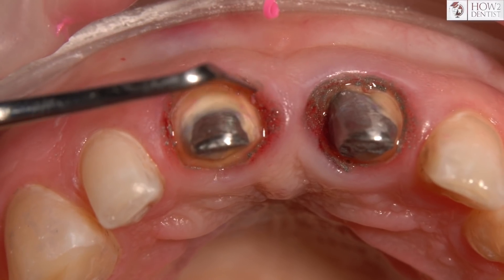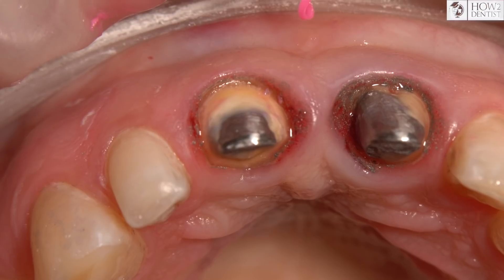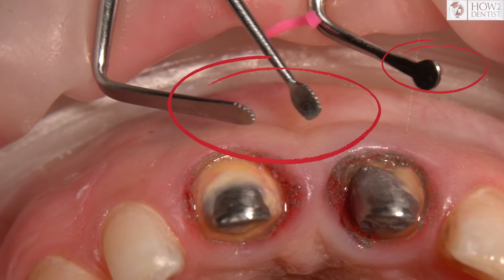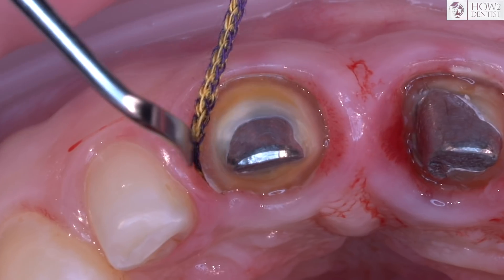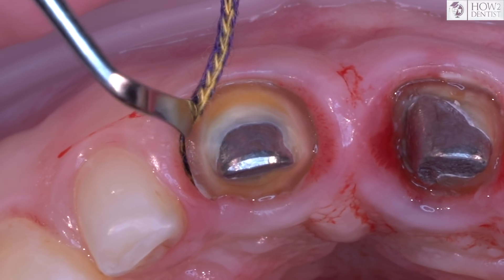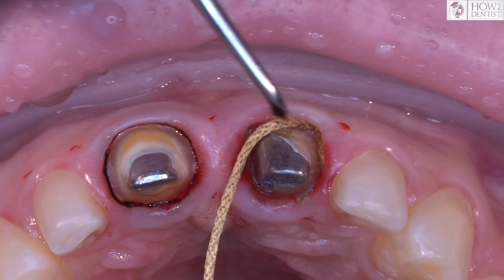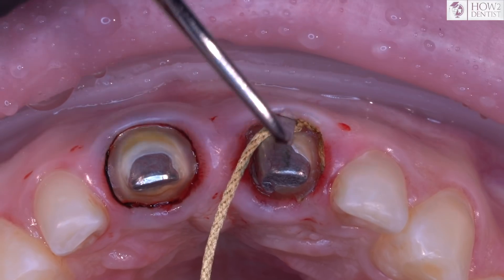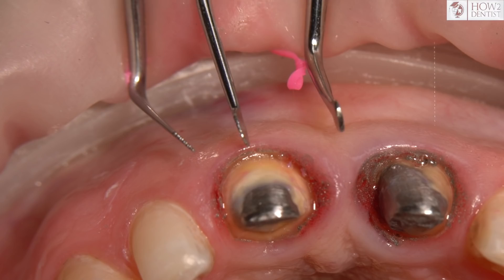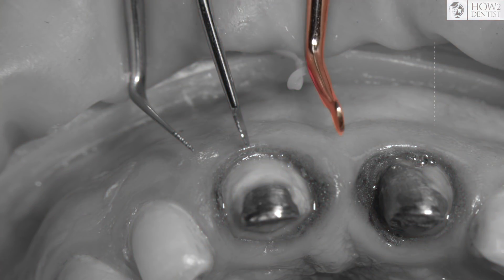Probing the gingival sulcus with a packer helps with the choice of cord size. The working part of the tool can be with denticles or smooth. Smooth is convenient to work with cotton cords — the fiber does not cling. A packer with denticles is more convenient to work with a synthetic cord, as the cord does not slip.